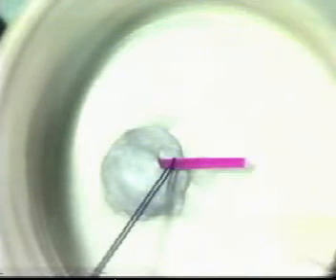Once complete, you are in a position to cut the suture. Ensure that no tension is actually placed on the vessel itself at any time.